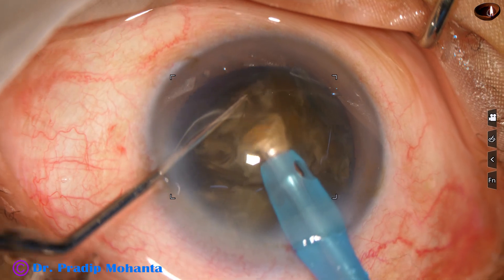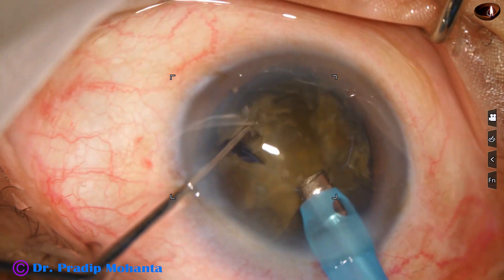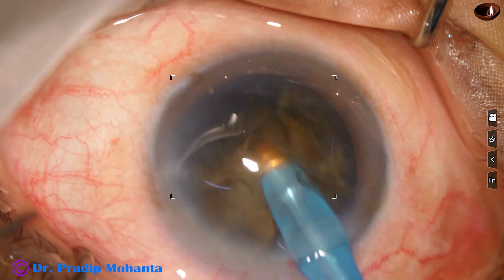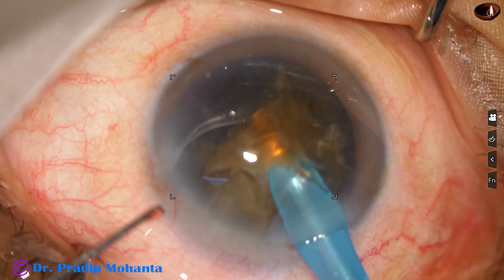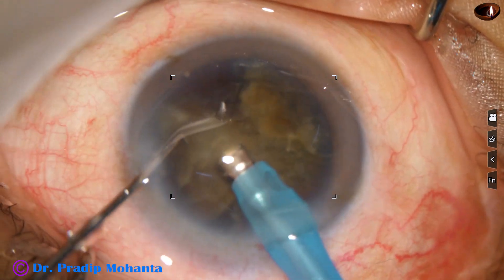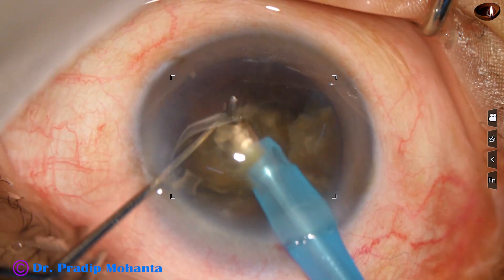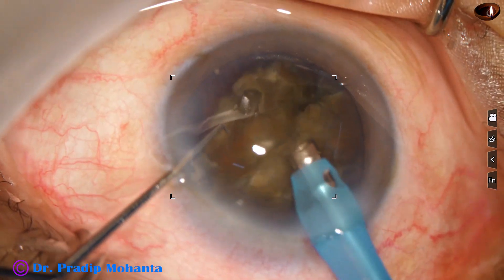This is a free nuclear piece and it is being emulsified. Ultrasonic energy used is 80%, flow rate is 45 ml per minute, and vacuum is 450 mmHg. The machine is the Oertly Catarex 3.